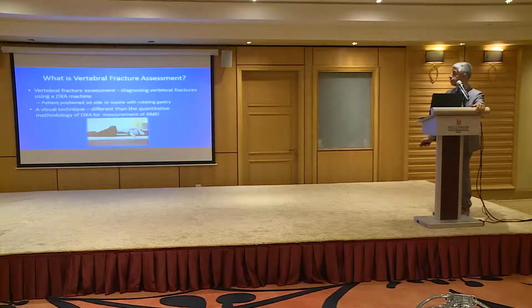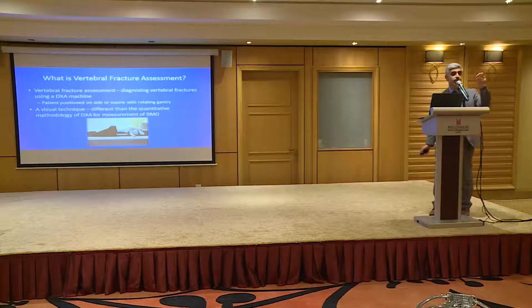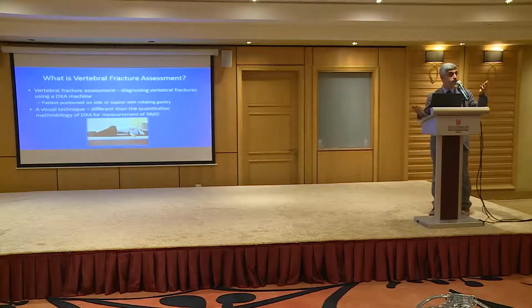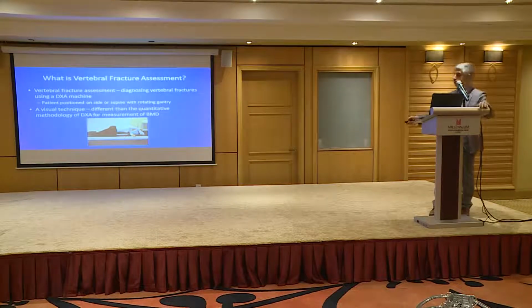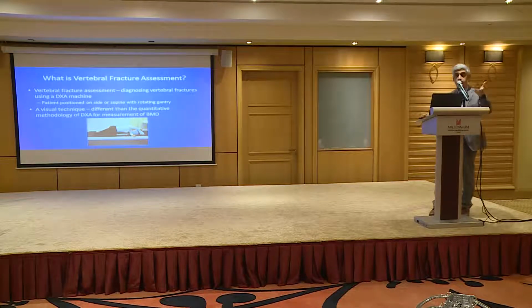So it's a tool that we use to look at the whole spine to see if there are any hidden fractures in the spine. We use the same DEXA technology, but a slightly different software, and the patient needs to be positioned in a different way. It comes from the same DEXA machine, and we can look at the spine to see if they have any hidden fractures.